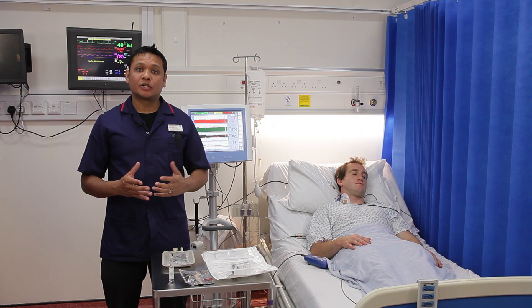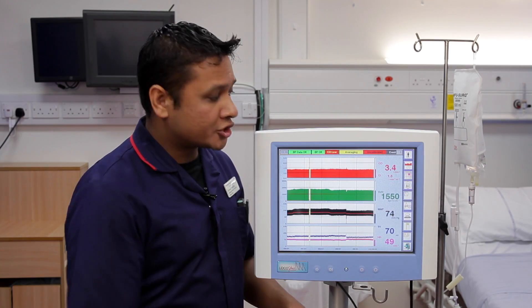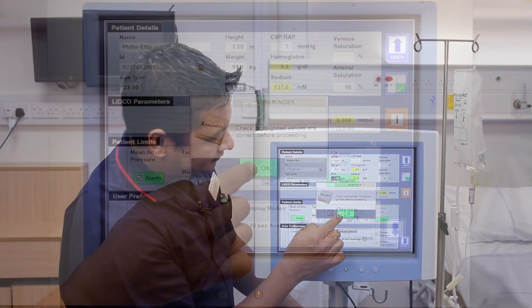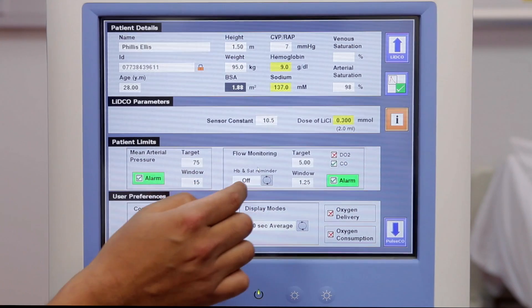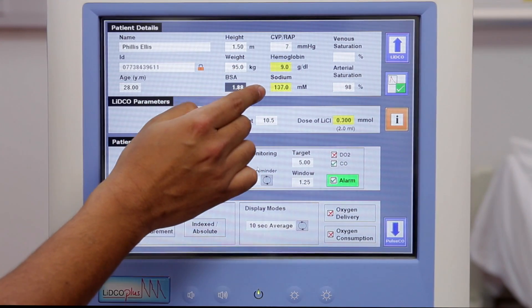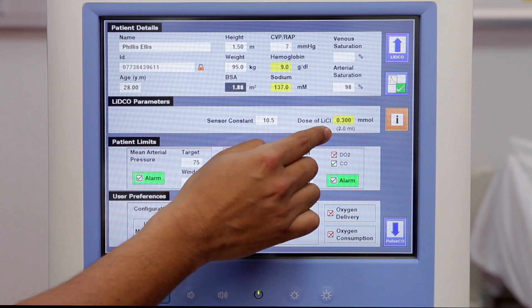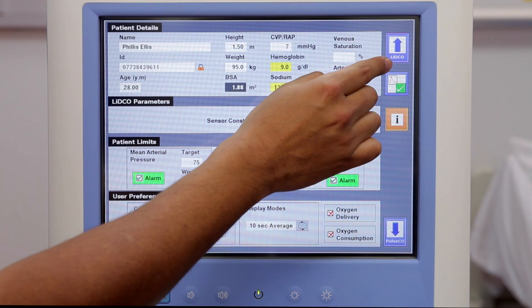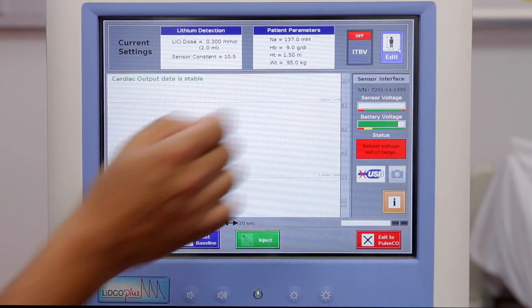In this section, you will learn how to calibrate the LitcoPlus. Before we start the process, touch the Litco button twice and press OK. Make sure you have updated the haemoglobin, the sodium and the dose of lithium values. Once you have done this, press the Litco button in the top right-hand corner to enter the calibration screen.